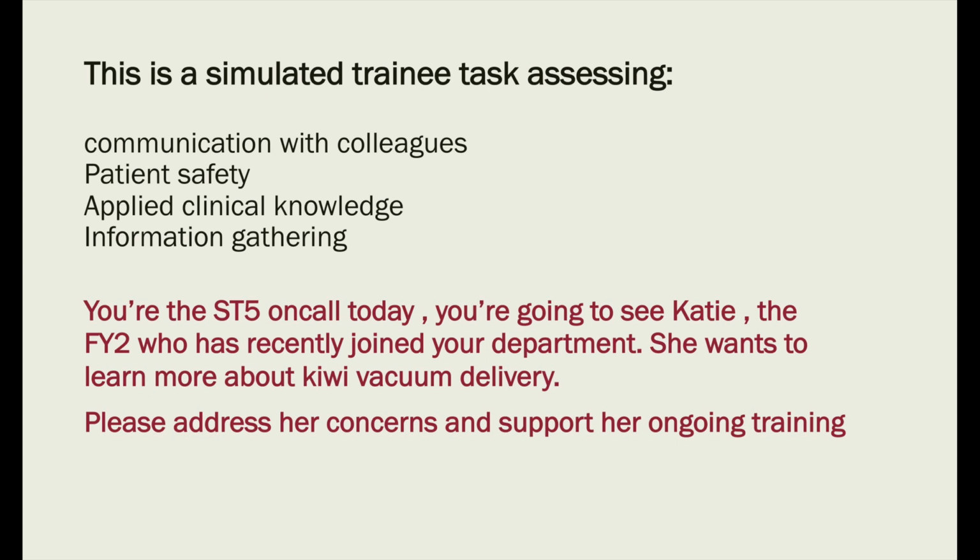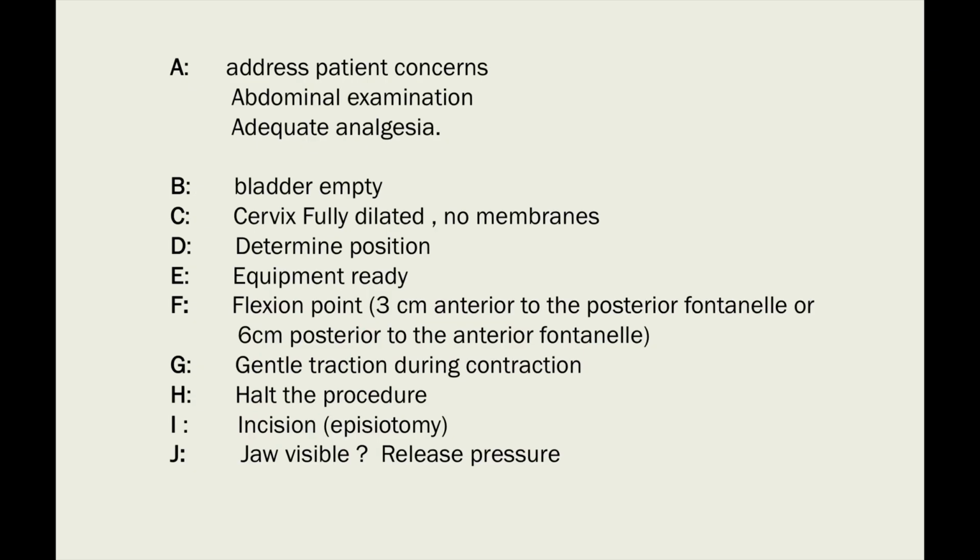Okay, so I will now tell you about the procedure itself. First of all, we have a mnemonic just to understand and not to forget any step, including the prerequisites and the steps of the procedure. We'll start with the letter A. First of all, we need to address the patient. Before we have any procedure done, we need to speak to the patient first and tell her about the complications and the possible risks, address any special concerns she has, and take her consent for the procedure. Okay? Okay. Yeah.